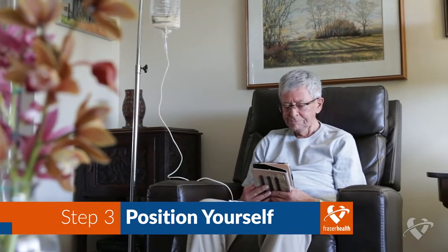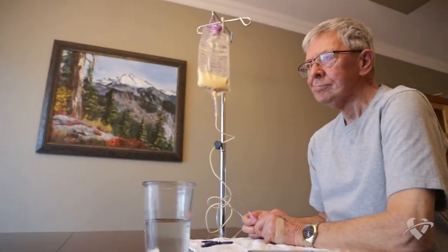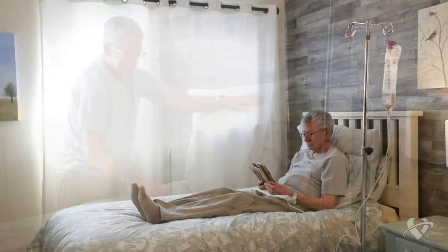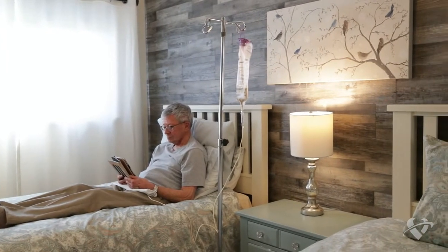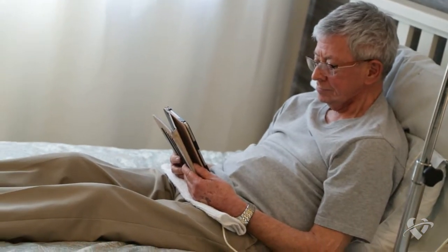Position yourself to be upright during feeding. Whether you sit in a comfortable chair or at a kitchen table, the idea is not to be lying flat. If you are in bed, use pillows to prop yourself up to at least a 30 degree angle. Try not to slouch or lie flat, as this could result in formula going up into your esophagus or even into your lungs.